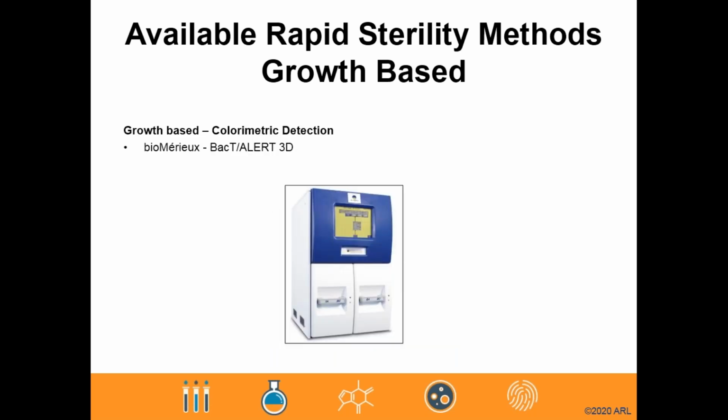One common rapid sterility system which utilizes colorimetric detection is the BacT/ALERT 3D. This is from bioMérieux. This system was originally designed for clinical applications, but has also been found to be suitable for testing of some pharmaceutical materials. Testing using the BacT/ALERT 3D equipment begins with samples being added directly to bottles of liquid culture media, which are then incubated inside the system at 2 different temperatures.